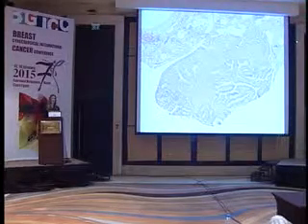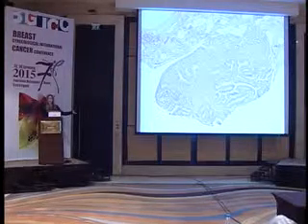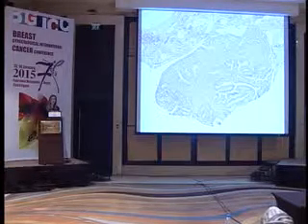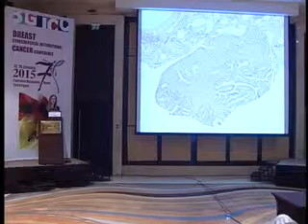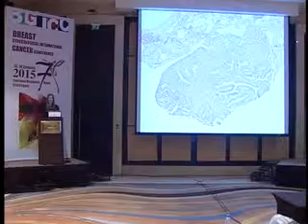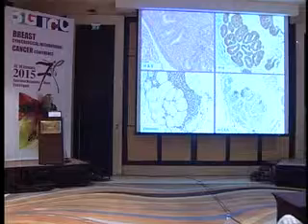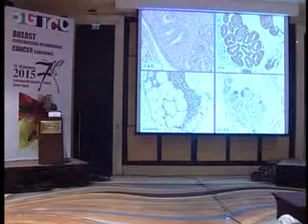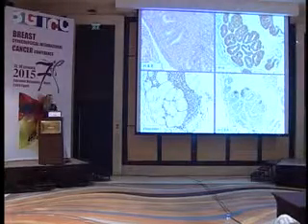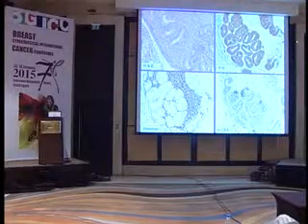Before that, let's look at this. What do you think? If you think this is in the cervix, raise your hand. This is ECC, and it's a real case. So, you think it's in the cervix? Endometrial, raise your hand. So it's kind of 25-25, another 50 are not with me, or they are debating. Okay, look at the stains. H&E, P16 diffusely positive, Vimentin in the gland is negative, CEA is positive, so I made up my mind to say it's in the cervix.